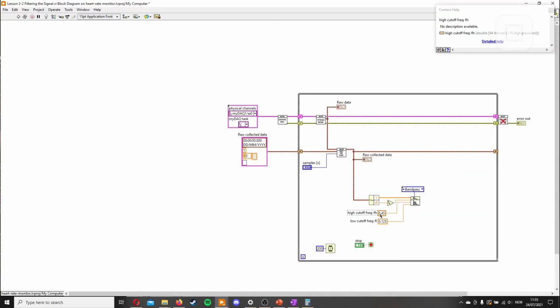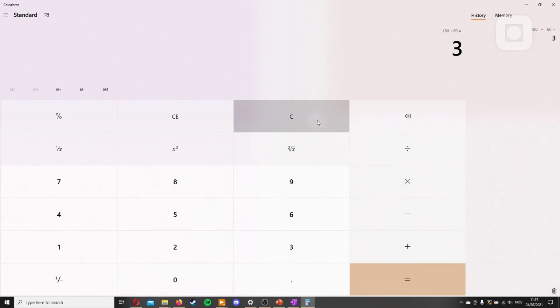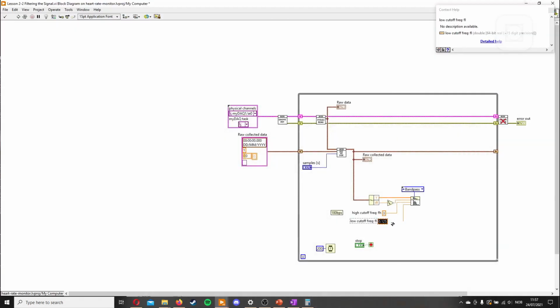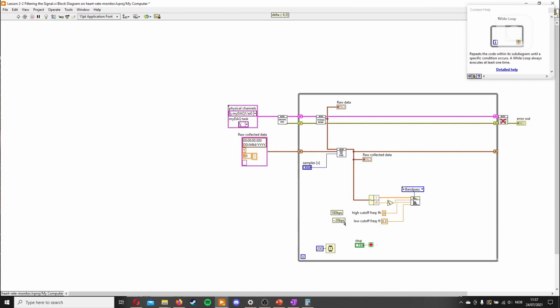This gives us a nice number 3. So let's clear it, and let's take 20 divided by 60, which is 0.333. To make it easier, we'll just say 0.3. This is a nice range, and then we'll just add about 20 beats per second. We don't need it to be exact here, because we're going a lot lower than we would. We just need ballpark numbers here.